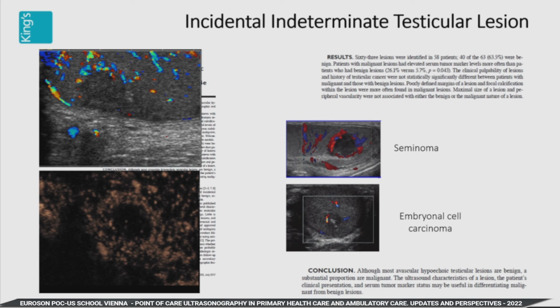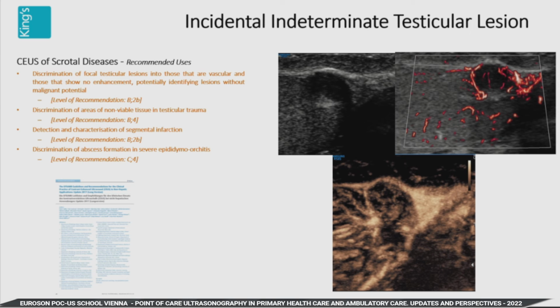So if you've got a bubble going through a tumor, it's got a vessel, because the microbubble is truly intravascular. It doesn't leak. So that area is microvascular. But what you can use is a MIP technique, where you summate those microbubbles. And in this lesion here, which has got a little bit of color, as you map it up and summate it, you can see that you've got vascularity in that tumor.